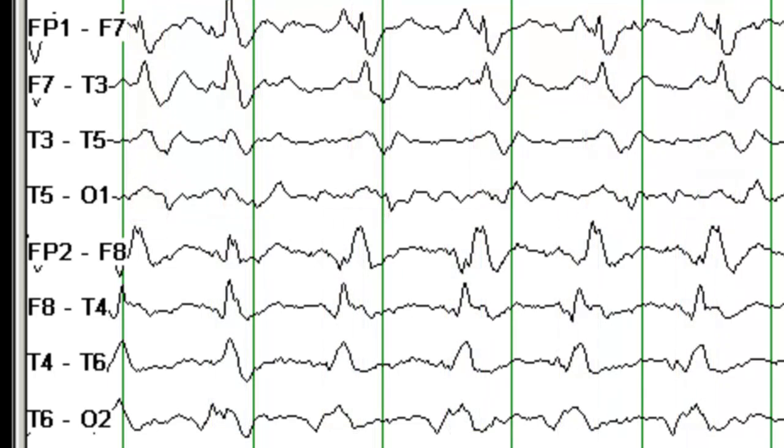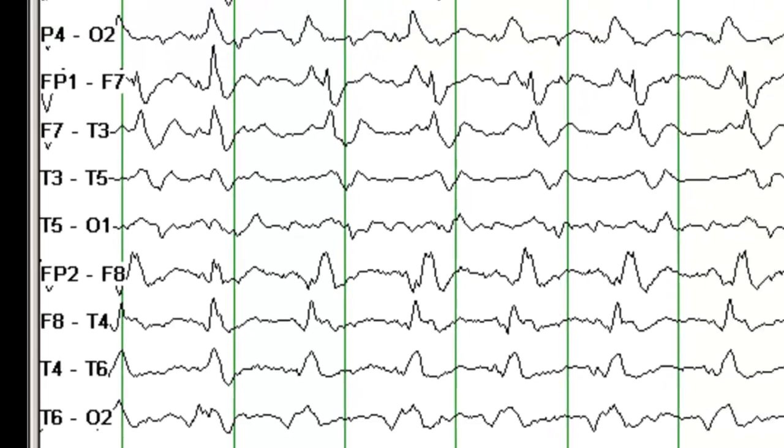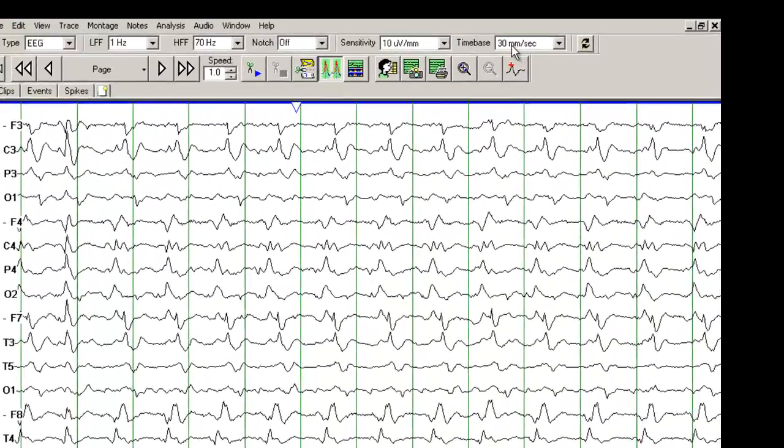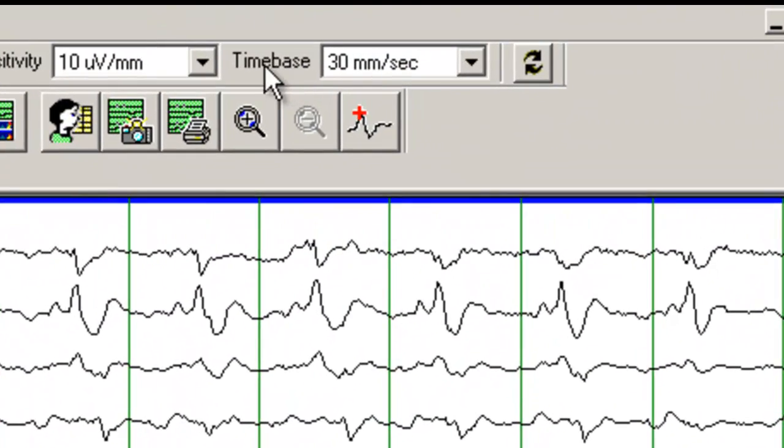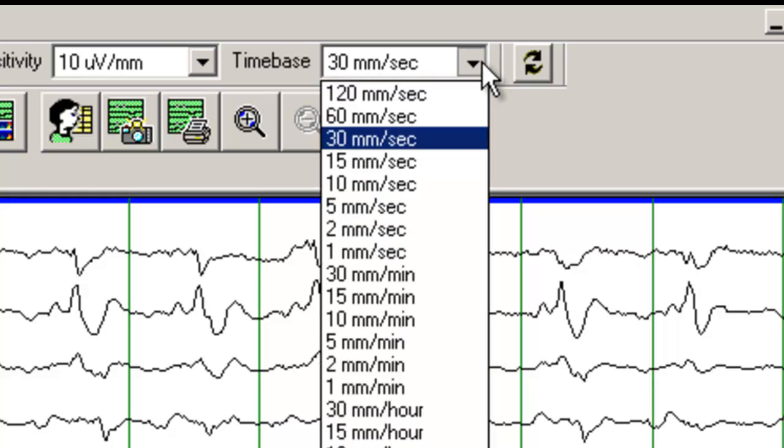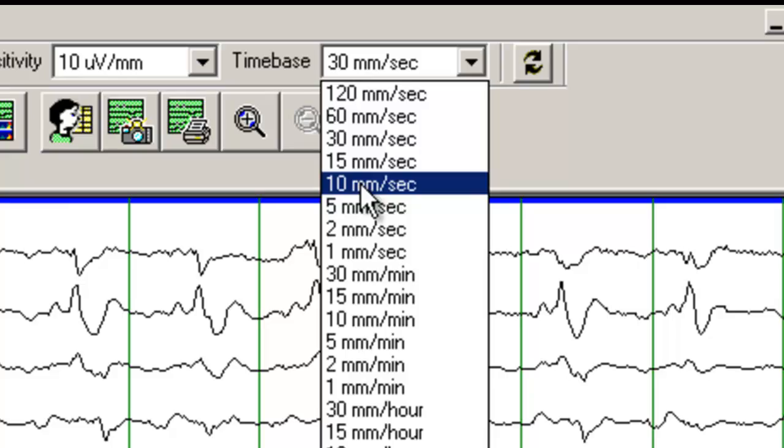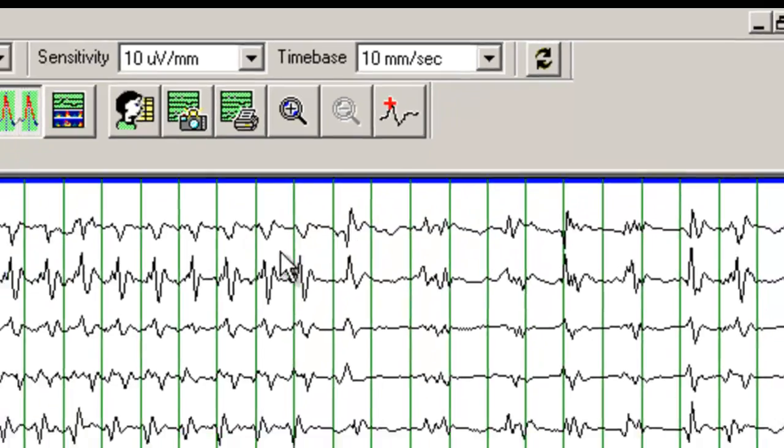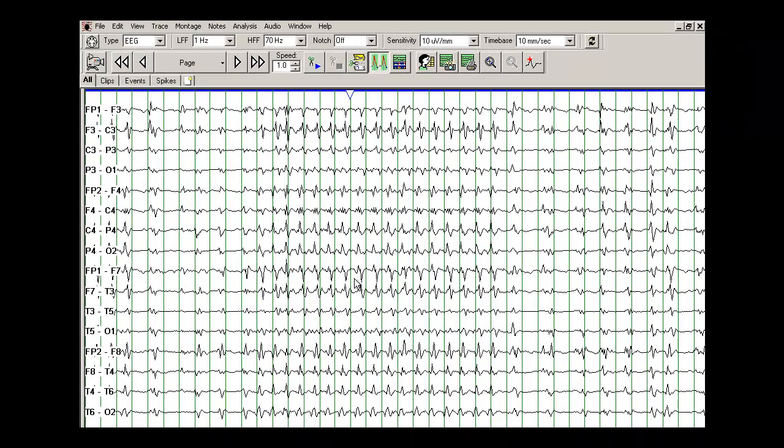Another way of looking at this EEG is to compress it. So if you look over at the time base, at the present time we are looking at 30 mm per second. Let me change it to 10 mm per second. And this all gets compressed.